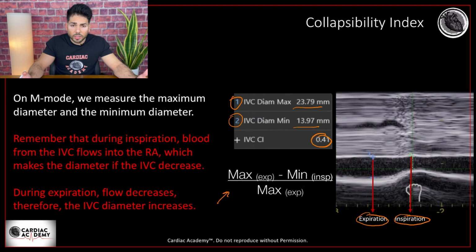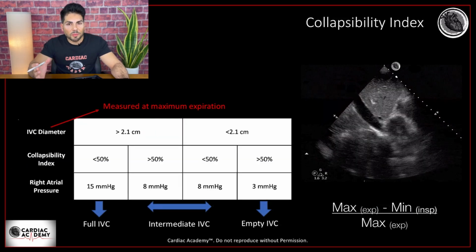In this case, that means that the IVC is full. It means that the IVC is collapsing less than 50%, which is the magic number, which we're gonna see right now, okay?